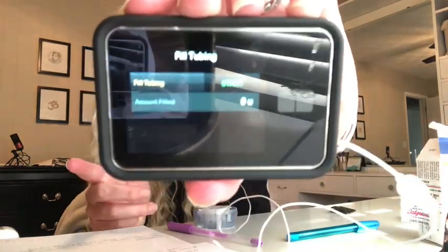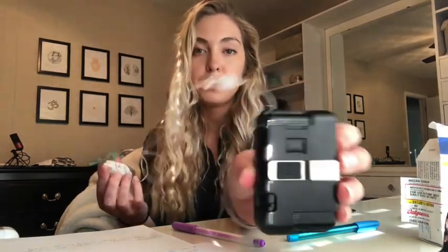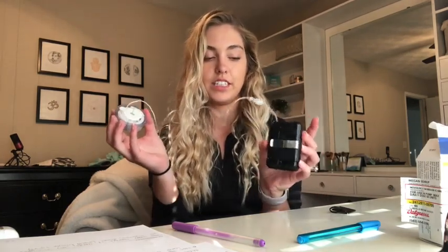And then it comes up with this screen, and I want to start filling the tubing. Because this is all filled with air right now, and I want to fill it with insulin. So I'm going to start, but a trick that I was told to do is to hold my pump upright so that any air bubbles come to the top and are pushed out. So while it's filling, I'm gonna hold the pump upright, and I'm also going to hold my insertion site and make sure that insulin comes out on this end. This takes a little while. It takes like 12 to 13 units for me to fill this.